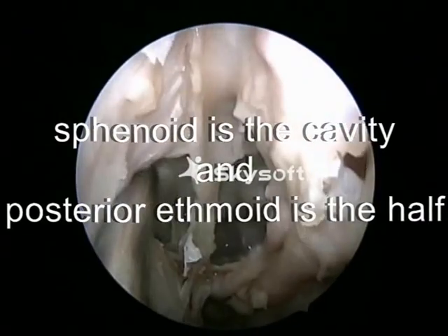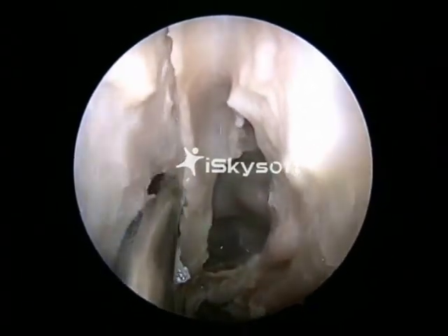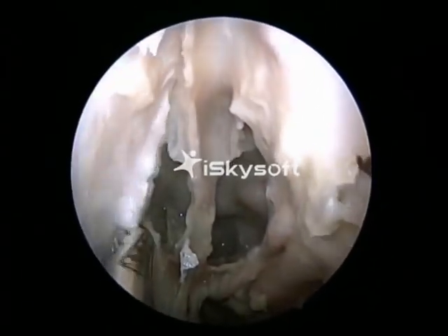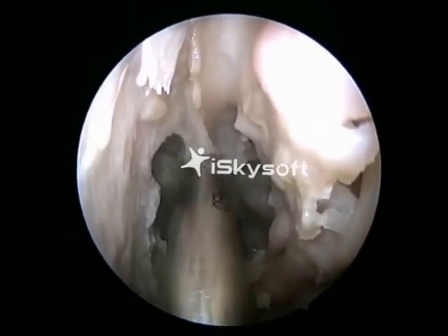Now we are doing a posterior septectomy. A debrider is being used to remove the septal mucosa on the other side.